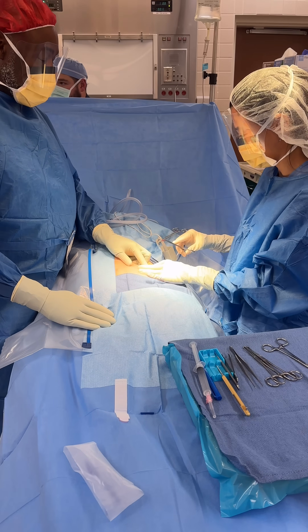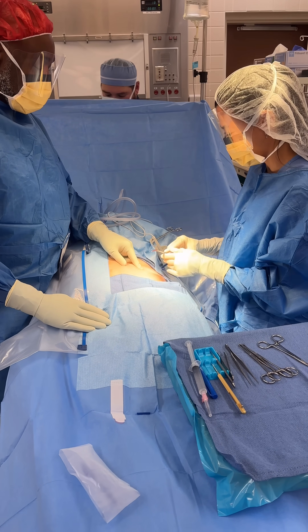Okay, let's pick it out. So she has a chronic abscess.